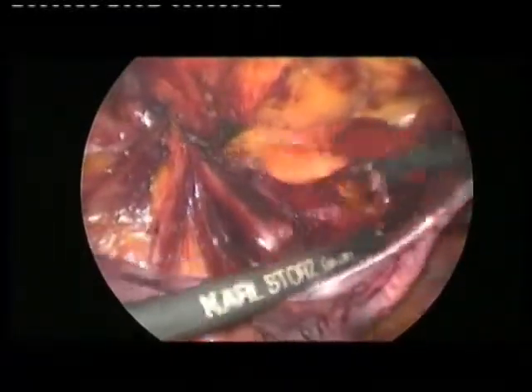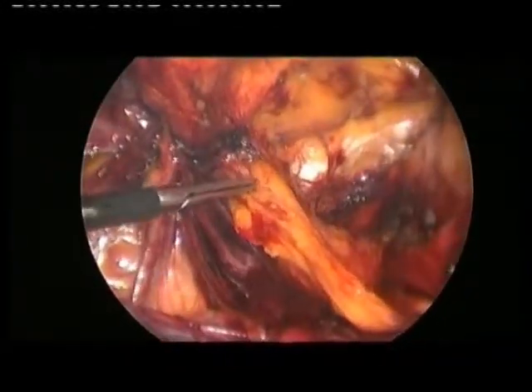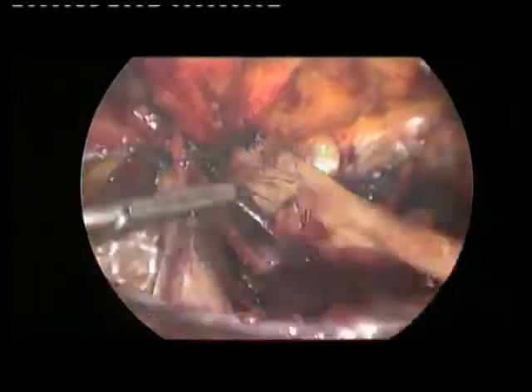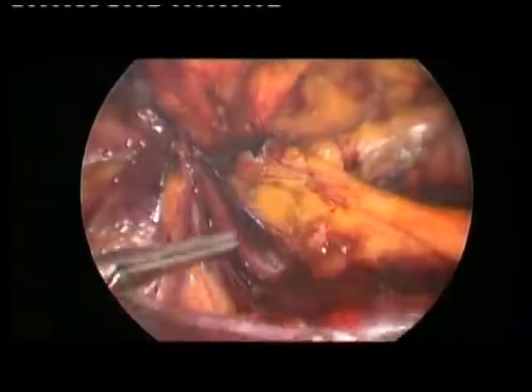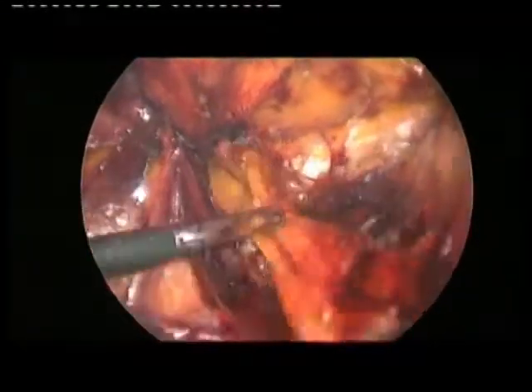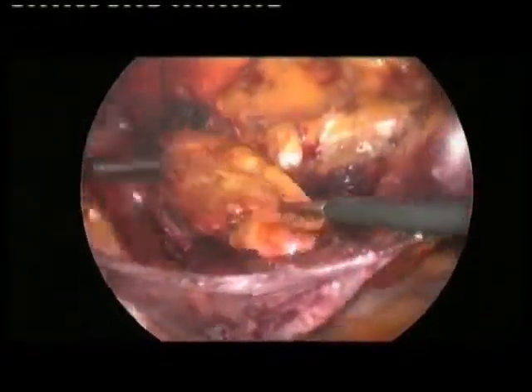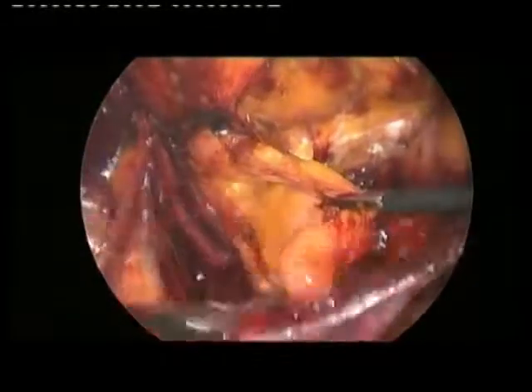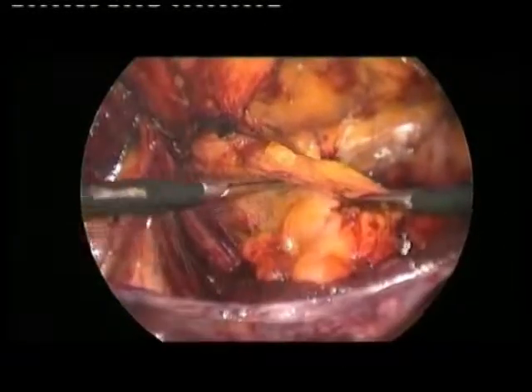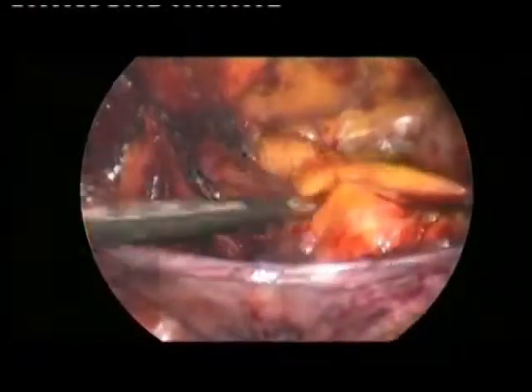In my experience of recurrent hernia repair, I repair a lot of pseudo-recurrence. I mean, a patient operated by open surgery who had a recurrence, and most of them were sent by other surgeons, and during laparoscopic exploration, I found that they did a good job in the inguinal region, but the recurrence was a crural recurrence. So, you see?